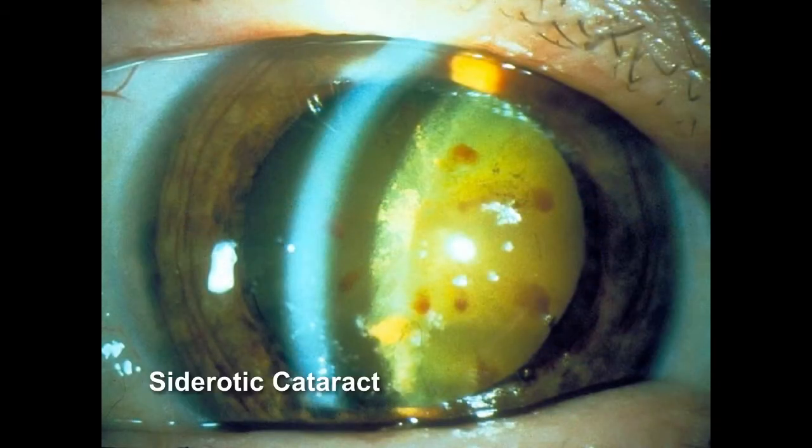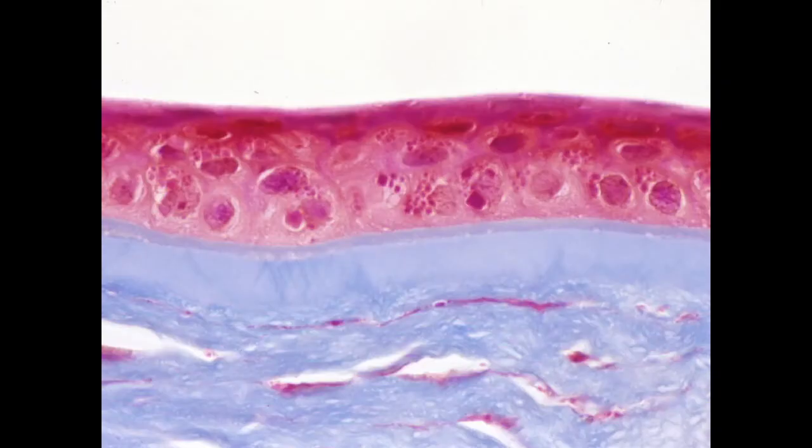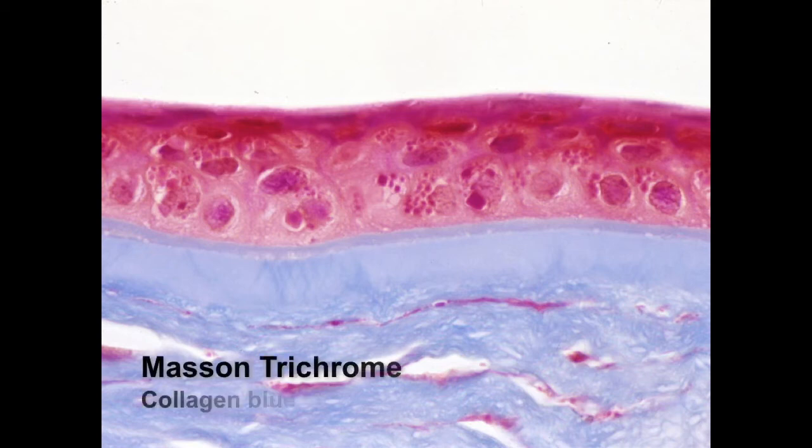This is an example of a siderotic cataract from a retained iron foreign body. The H&E is shown above, with a sort of brownish discoloration. The iron in the epithelium is disclosed below by the intense blue staining. Masson trichrome stains collagen blue and cells red.